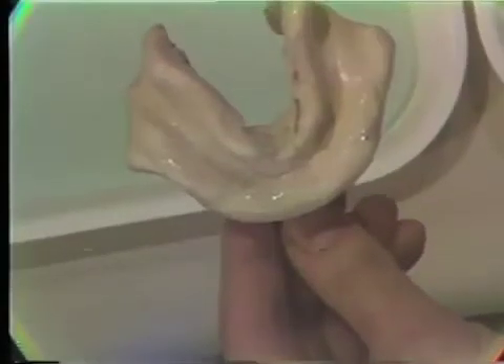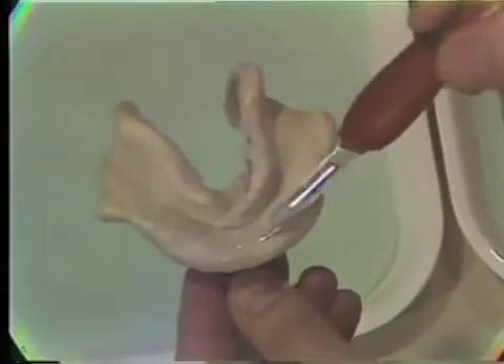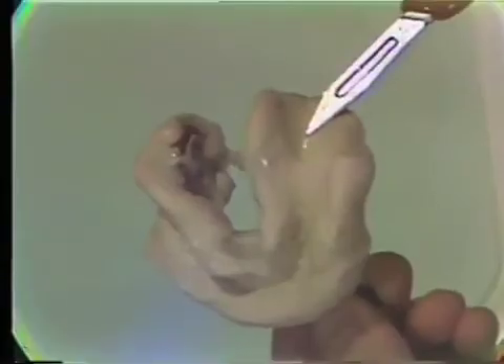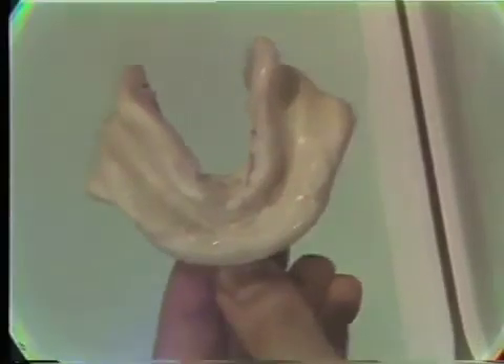After removal of the mandibular impression and inspection of the patient's oral cavity for debris, the impression is inspected for landmarks and outline form. The impression should include the retromolar pads bilaterally, the buccal flanges, the buccal frenum bilaterally, the labial flanges, and frenum anteriorly. The lingual flanges with distolingual extensions is a must in the preliminary impression and is often difficult to achieve.